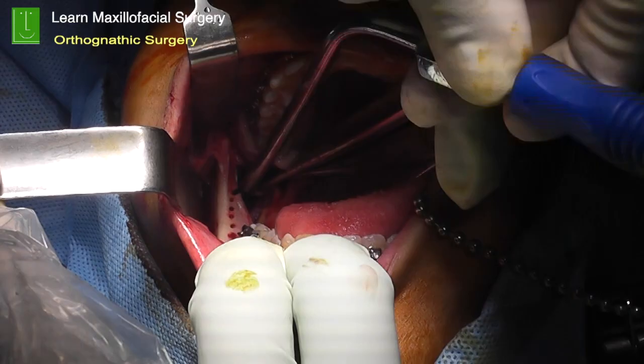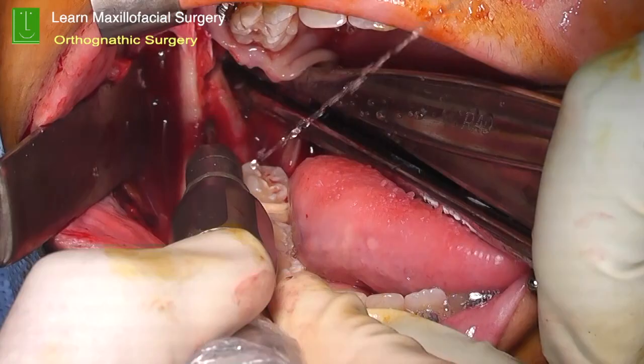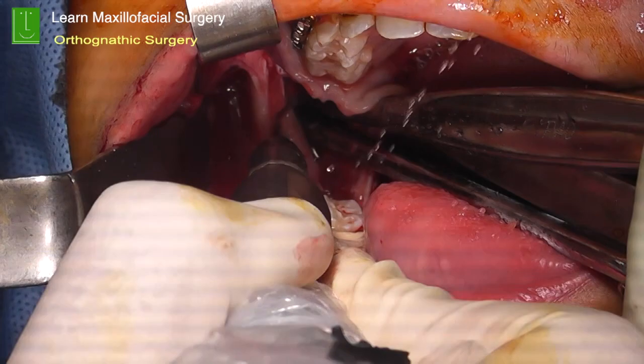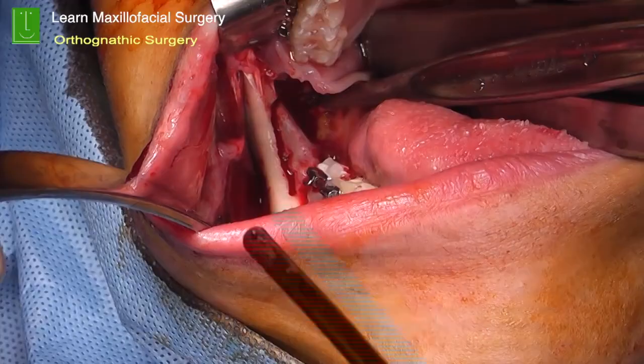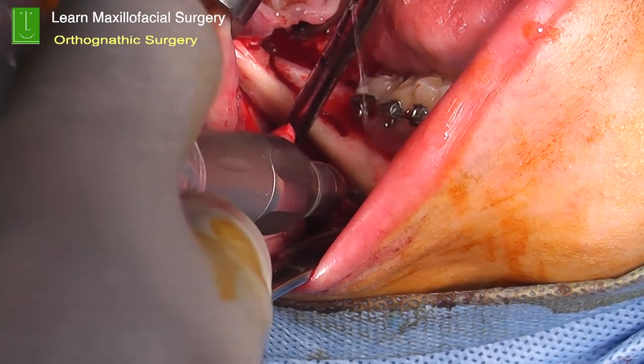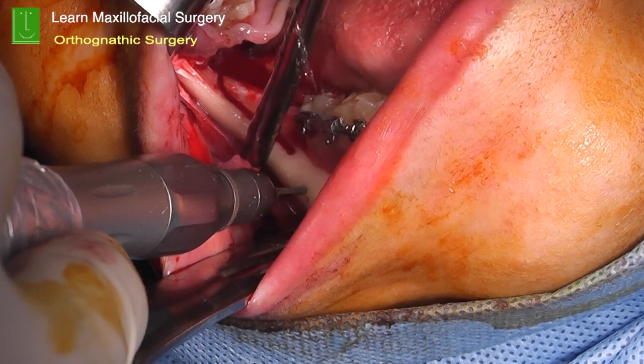Now the lingual cut. Hugo Obwegeser basically described the sagittal split osteotomy, and then Dal Pont modified it. And the key is to understand that the lingual cut is essentially made up to the lingula. Then the vertical cut is made. I like to use a postage stamp method, and then joining these vertical cuts, and then you have to do the buccal cut. And to do the buccal cut, it's a very good idea to use an OTI retractor or a channel retractor, and you can basically make a straight vertical cut going from the lower border of the mandible to the second molar region.